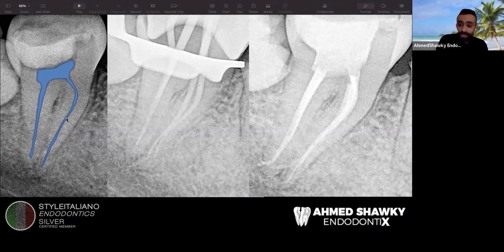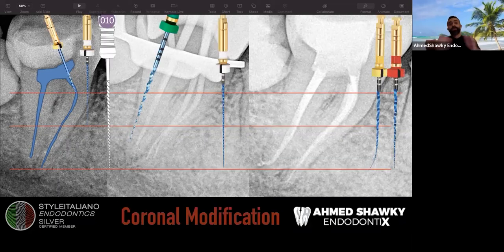So what we did to reach a successful outcome of shaping and treatment is to do this. Let's see my sequence with MG3 blue in this difficult case. First, I use the starter in passive insertion and brushing motion in order to relieve some of the dentine resistance, which is massive here at the orifice. And then I go with the PX or the glide path file 1503, or sometimes 1504, to have the root canal, only have the root canal.